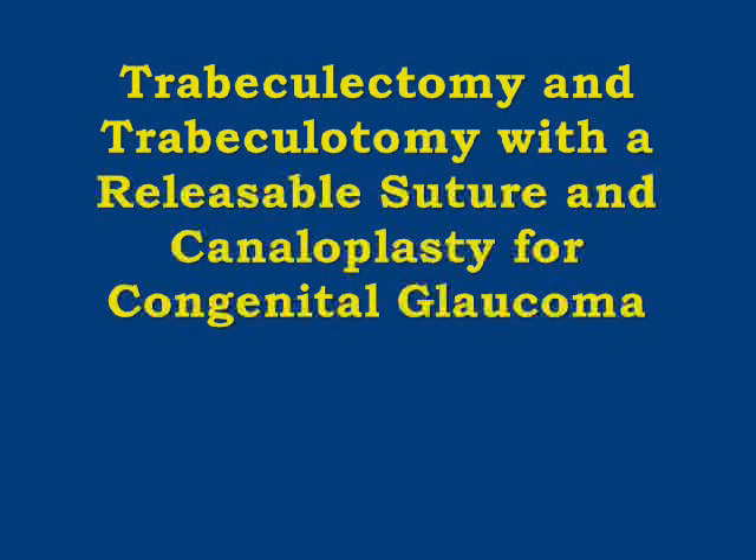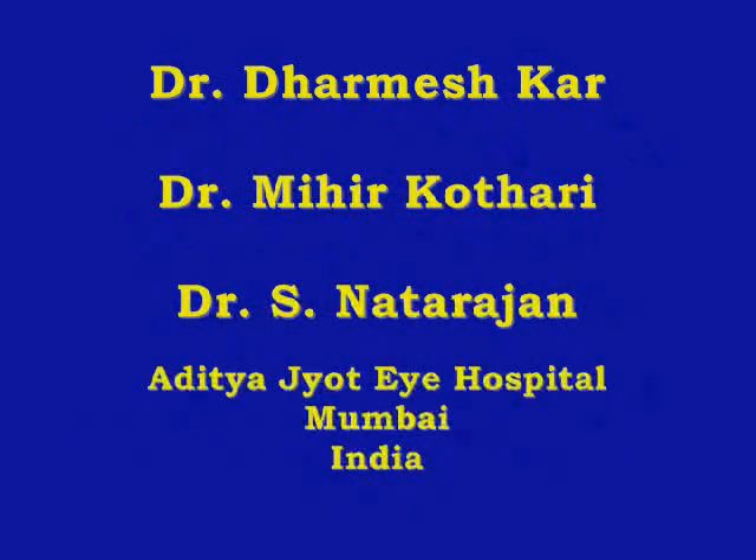This video demonstrates the technique of combined trabeculotomy and trabeculectomy with a releasable suture and canaloplasty in the management of congenital glaucoma.